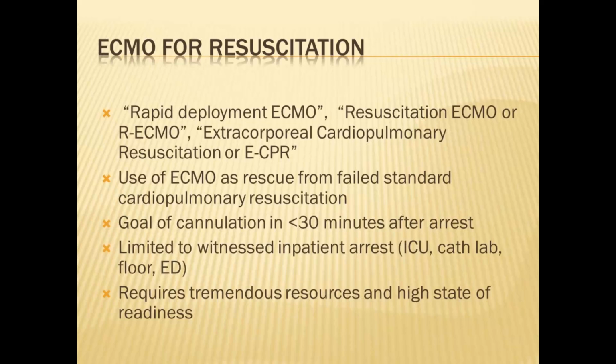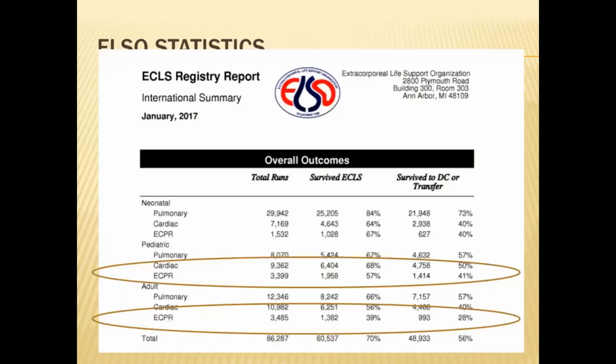So there are two things to work on. One is doing CPR, where you continue the CPR till the time you are able to cannulate and initiate ECMO. So it's always important that if the patient does not respond in the first 10 minutes of CPR, then your ECMO team should be activated. They should start coming in and preparing themselves, and if the patient doesn't respond, then you should start cannulating. But it has to be done in 30 minutes.